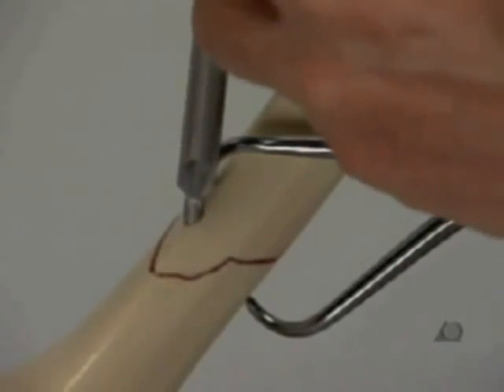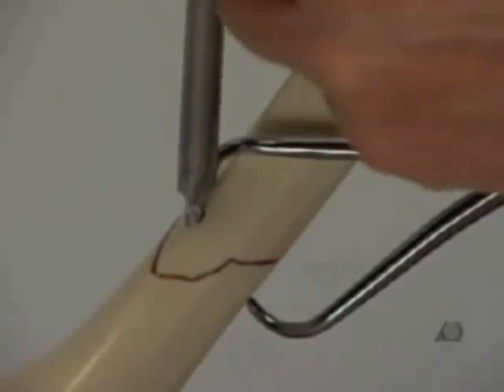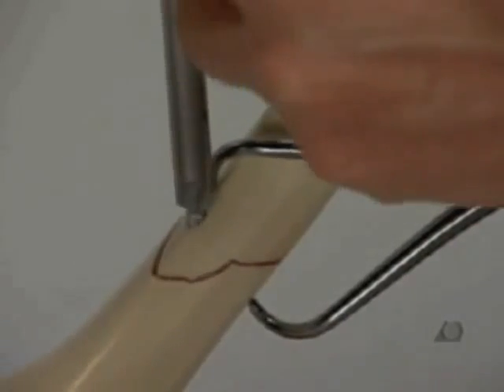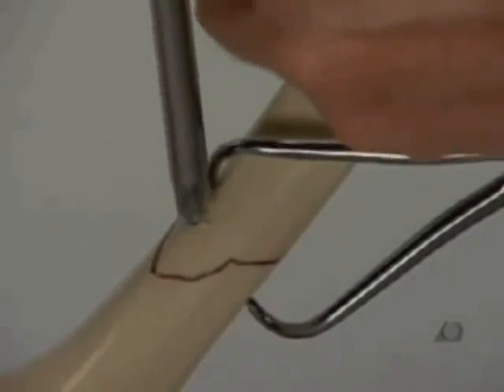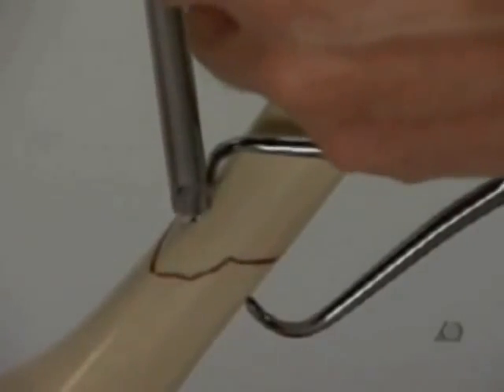On the tibial crest, countersinking is necessary, otherwise the screw head is too prominent.